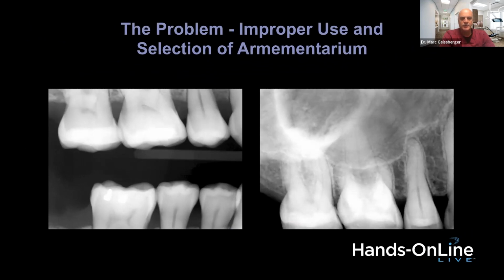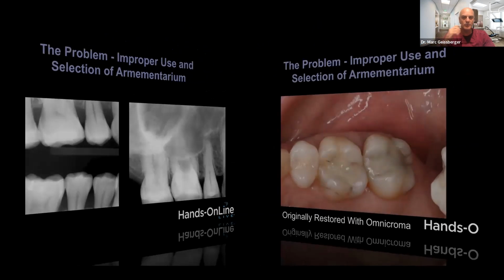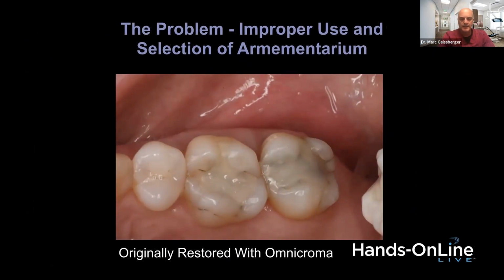And that happens routinely. So this restoration I had to take out. Not only that, there was recurrent caries under the restoration. Now, sadly to say, this restoration was only about 6 months old. So here's the clinical case.